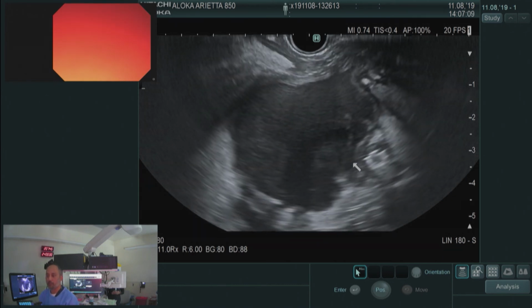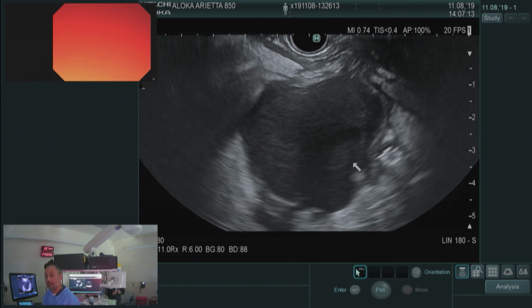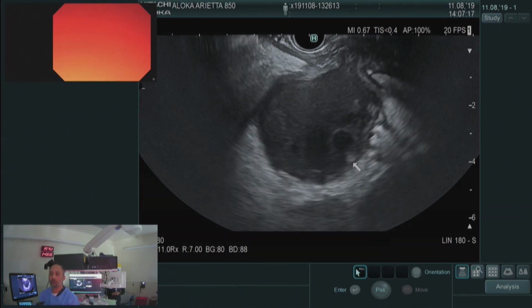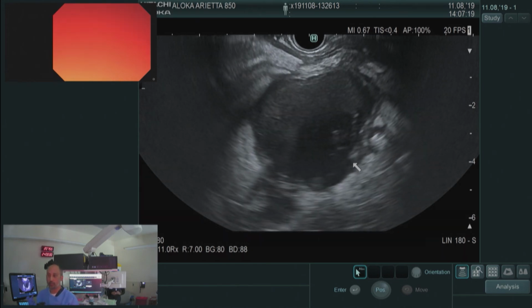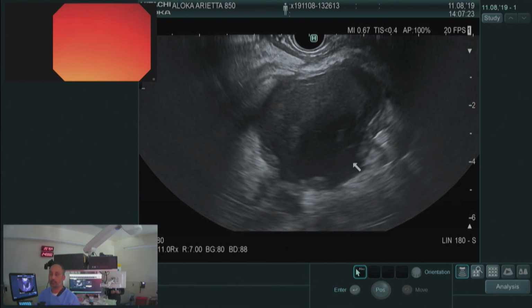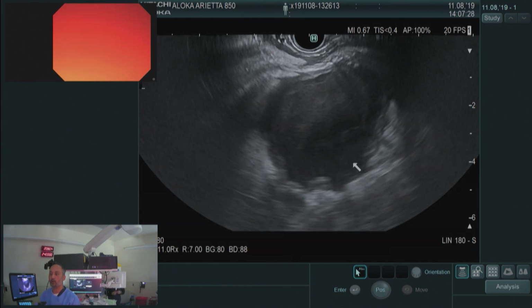The other things to keep in mind when we're looking at our cyst now is, what do the walls look like? Is this cyst mature? And we've discussed this last night. Traditionally, we like to see a mature cyst, a thick-walled cyst, usually wait at least 3 to 4 weeks. There is data that you can go in sooner if you need to, but ideally, I think most of us would agree we'd like to see a nice mature wall.